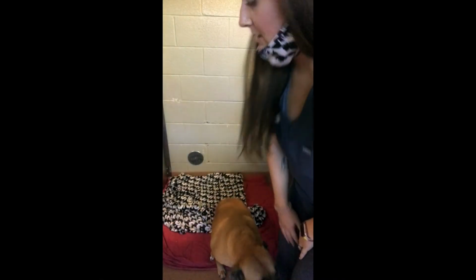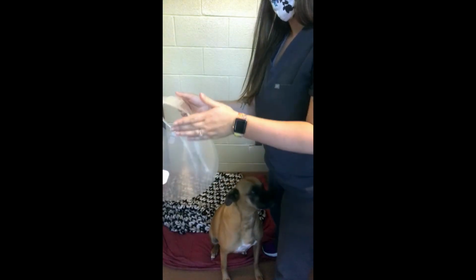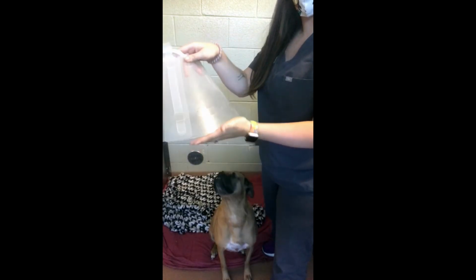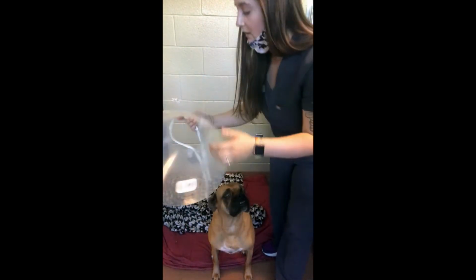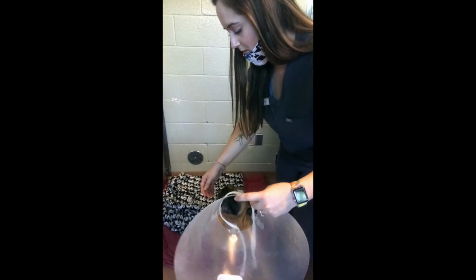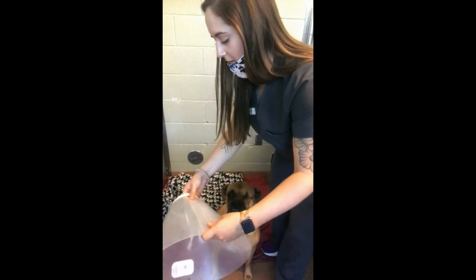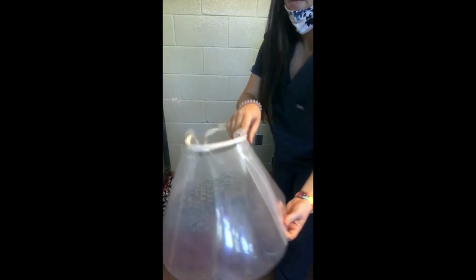So to place an e-collar on a patient, you want to make sure you have a collar that is long enough to where it extends beyond their nose. And then once you get that length correct, you want to measure it around the girth of their neck, and then put it together. So we have hers measured correctly and it's already put together.